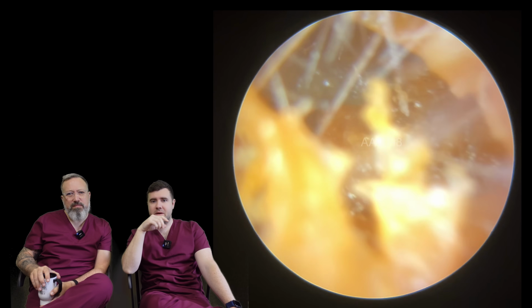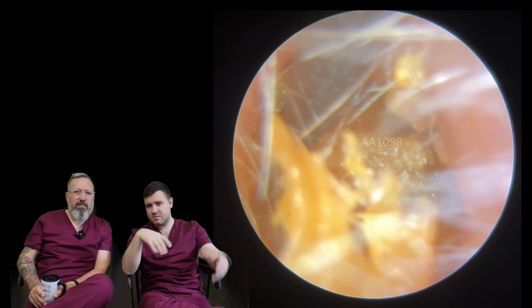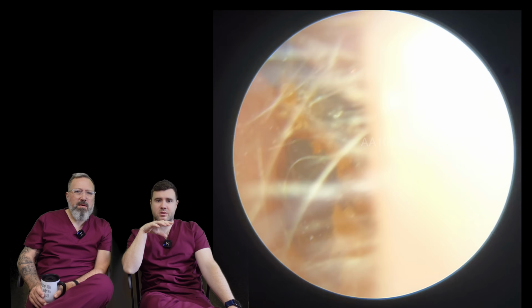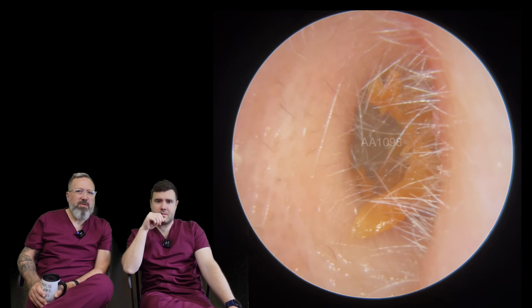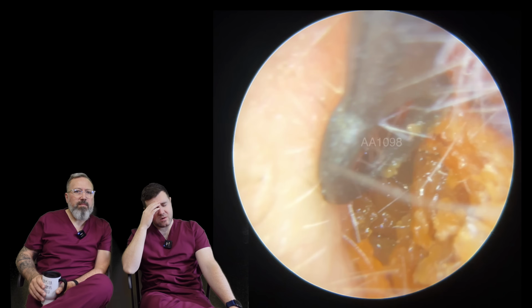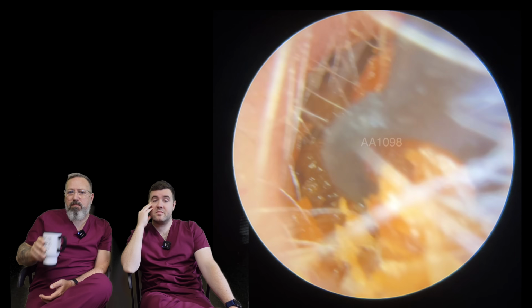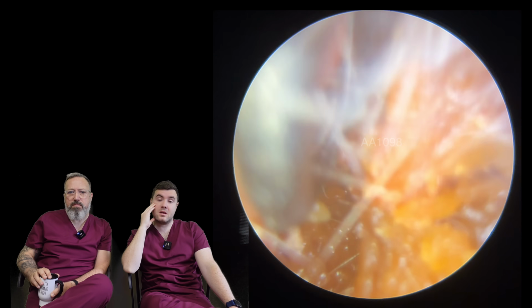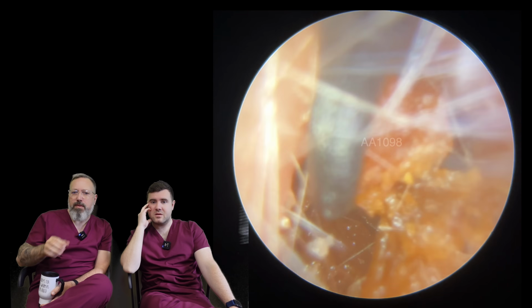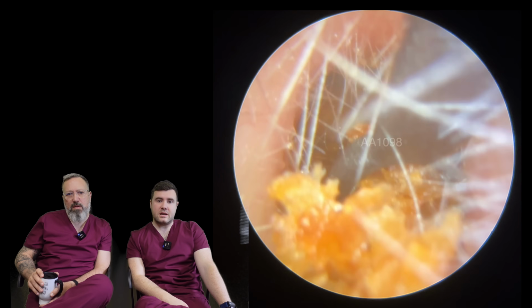You could see there was a little bit of a gap in this one. Patient was feeling something was in there, didn't feel quite right. So we've gone straight in with a curettage here. Was there a reason you went straight in with curettage on this one? Do you know what? This was done a little while ago. I do apologise if I'm wrong, but I think there may have been tinnitus present. I did wonder, because it's curettage all the way through, isn't it? Yeah, so there must be a reason for it. I think there was quite nasty tinnitus with this patient.